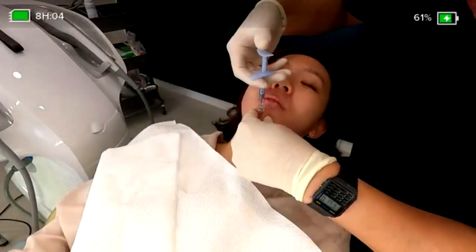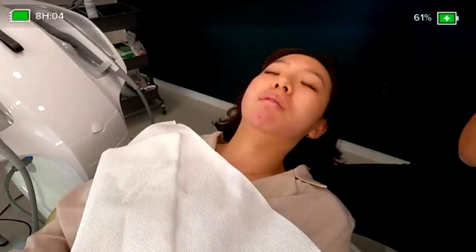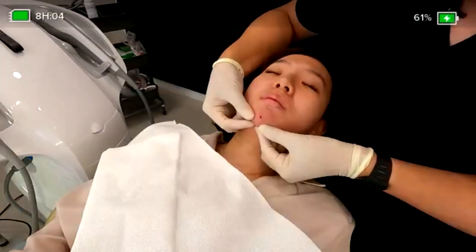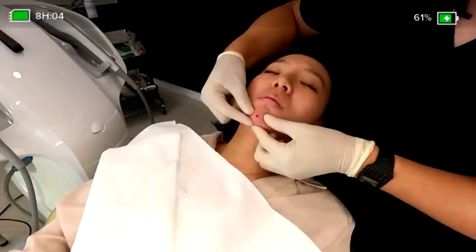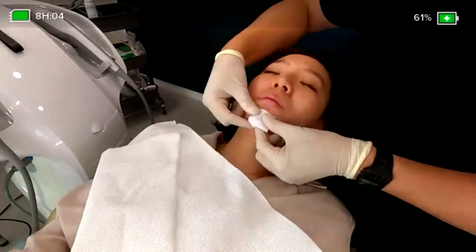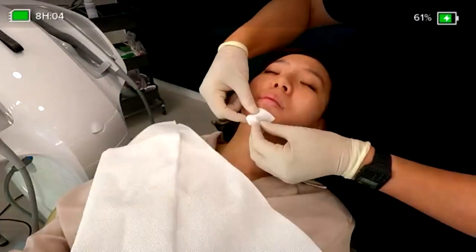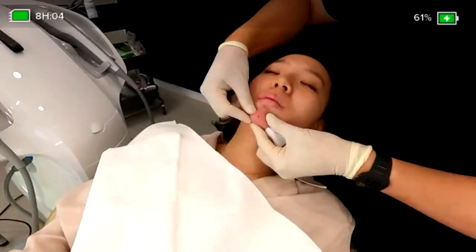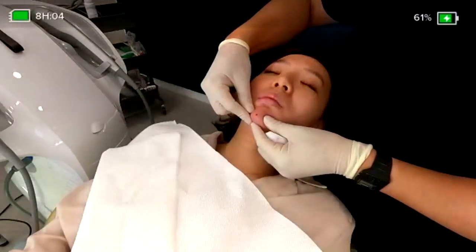So now we are going to do the amount. Usually when it's located on the chin, she has very soft skin here because of the cobblestoning, and you can see the mentalis muscle is quite small for the volume.